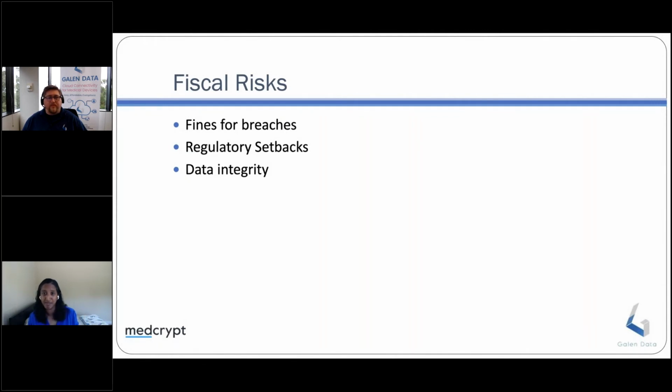Someone being creative in that environment decided to bypass the count that was actually happening there and overwrite the security check that was in place for it. And they were able to only pay for one operation per day, when in reality, this device was being used probably 17 times in that day. And this directly impacts your bottom line, right?